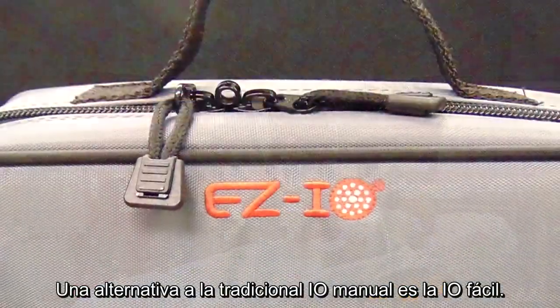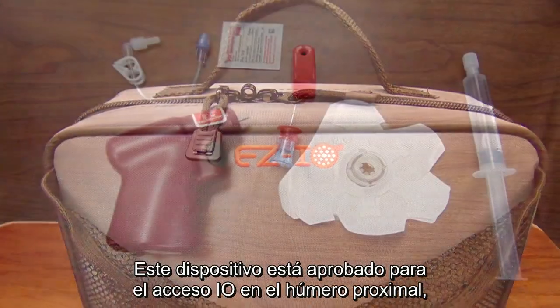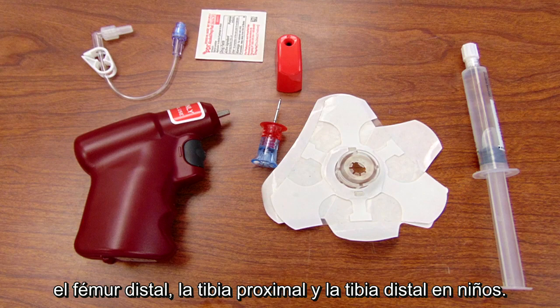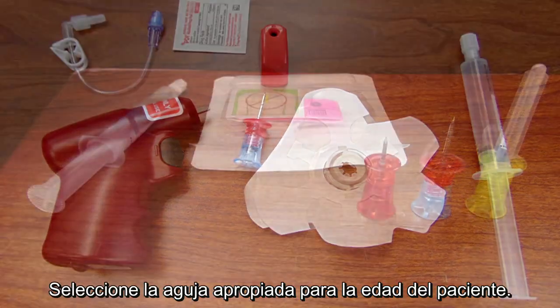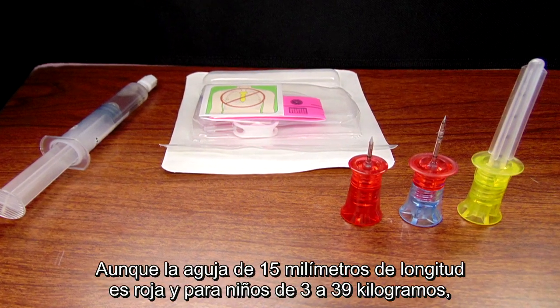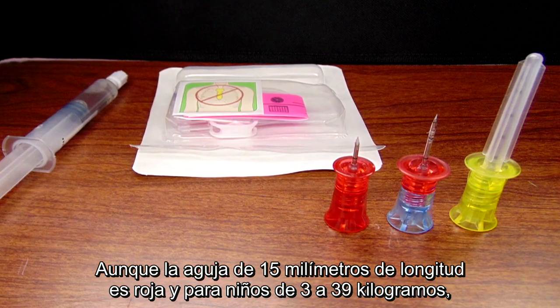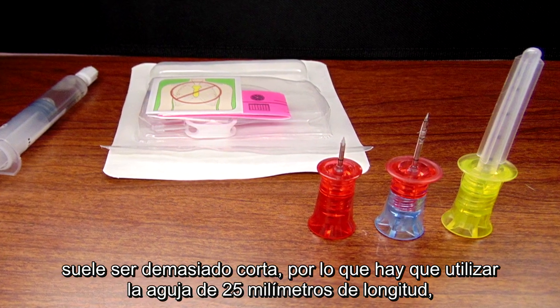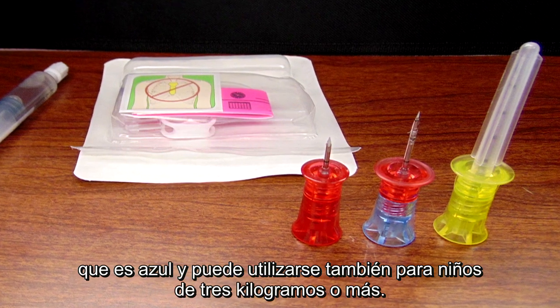An alternate to the traditional manual IO is the Easy IO. This device is approved for IO access in the proximal humerus, distal femur, proximal tibia, and distal tibia in children. Select the appropriate needle for the patient's age. Although the 15 mm in-length needle is red, and for children 3 to 39 kilograms, it is often too short. So, use the 25 mm in-length needle, which is blue and can be used for children 3 kilograms and above as well.